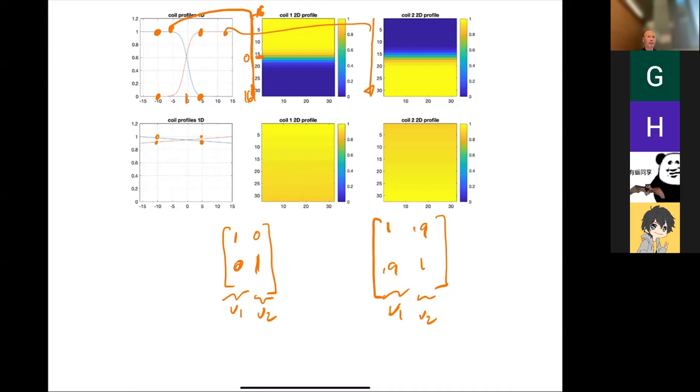Question. Say the coil's here, would it be pointing towards the top, or would it be pointing towards the magnetic field? Oh, the coil can be in any position it wants. For example, I could put different coils around a head, or I could put a coil here, a coil here, a coil here. The magnetic field is perpendicular to the skull.